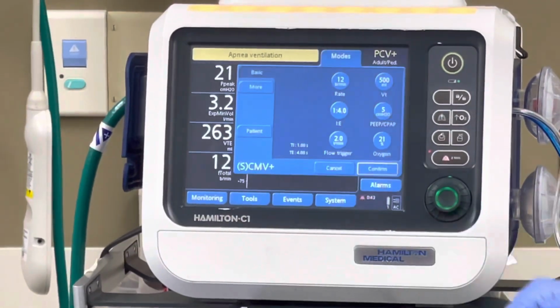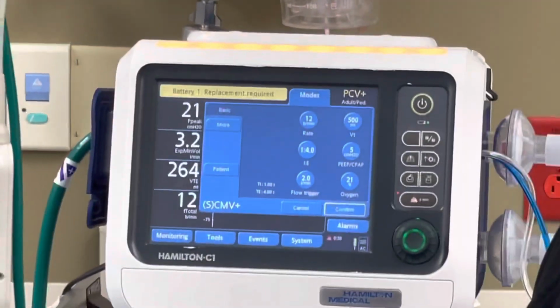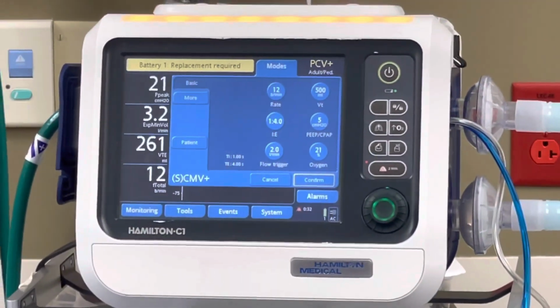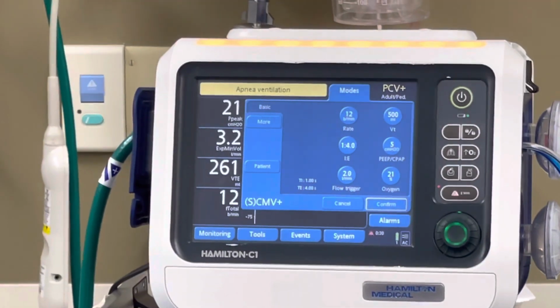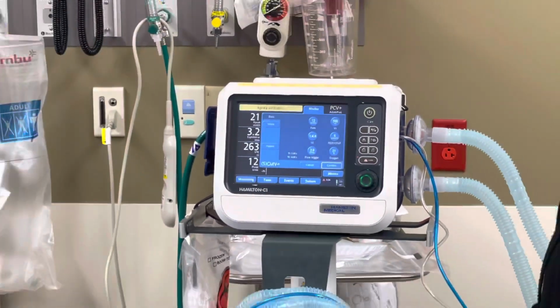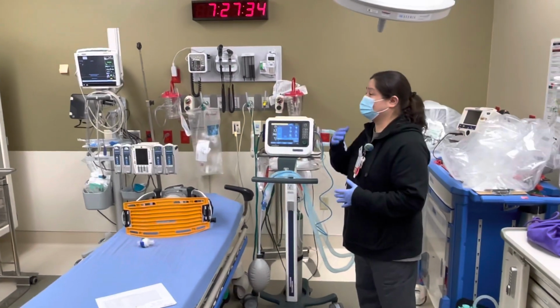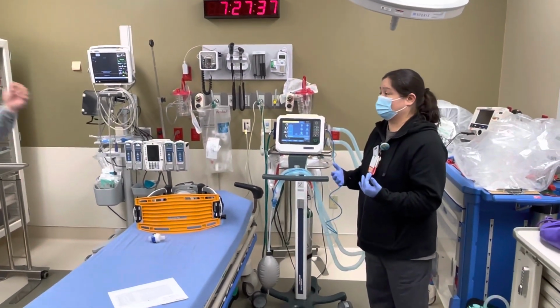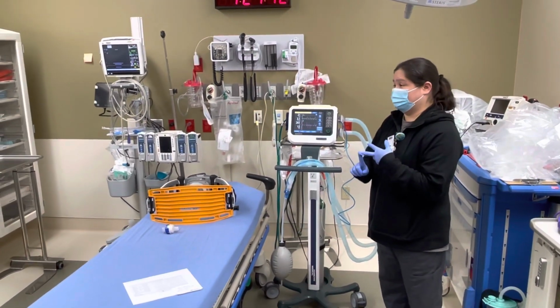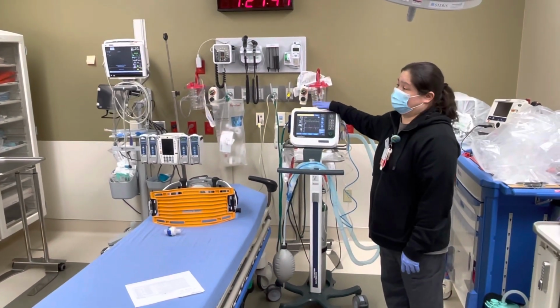Exactly. So my question is, okay, the numbers that the doctor gave you, if I come in here and say those aren't working, what would I be looking at to say, hey, doc, those aren't working? What would you like me to change? Really, in order to know if your vent settings aren't working, it's going to be an ABG. When you look at your ABG, depending on the values, if your CO2 is really high and your pH is acidotic and really low, then something's going on. Either my rate needs to be increased or my tidal volume needs to be increased. There's nothing in here I can look at for that, not necessarily, unless it's oxygenation.